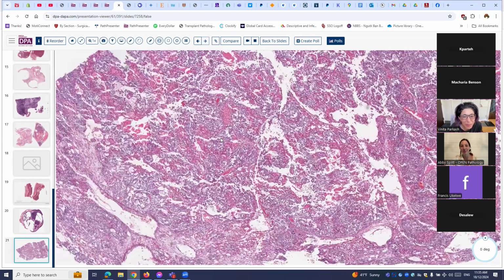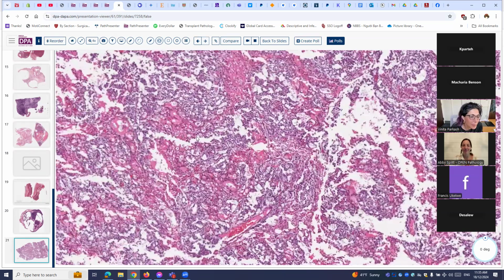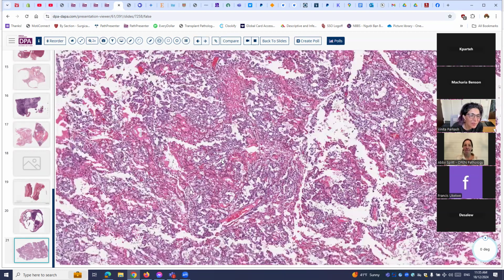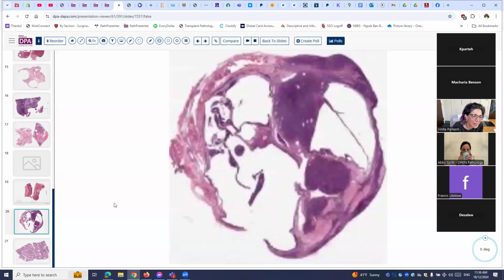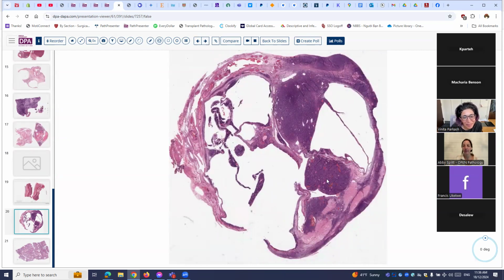So this is an ovarian mass, and actually, I think this is the same case that we just discussed that has another area. So let's go to a different tumor. This is an adult woman with a modestly enlarged ovarian mass and normal serum markers before surgery.